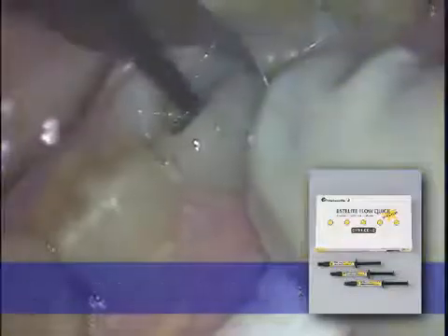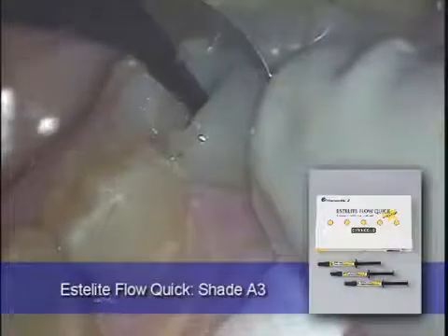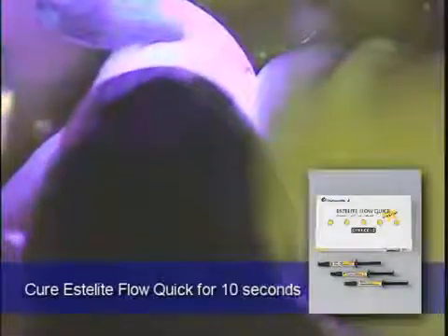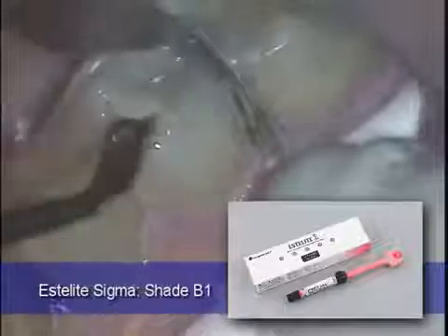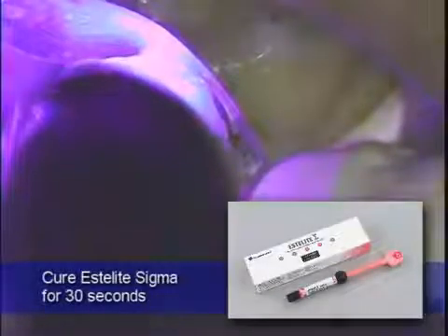Additional amounts of Estelite Flow Quick are placed into the undercuts and areas that would be otherwise difficult to reach using paste composite resins. The remaining occlusal layers are placed in 2mm increments using Estelite Sigma paste composite and sculpted to the tooth with proper anatomical form. These layers are cured for 30 seconds each.